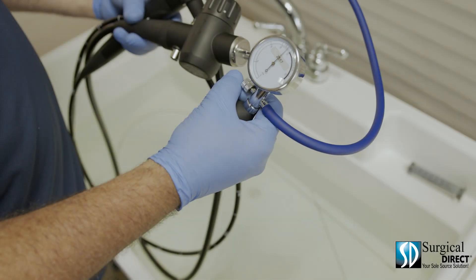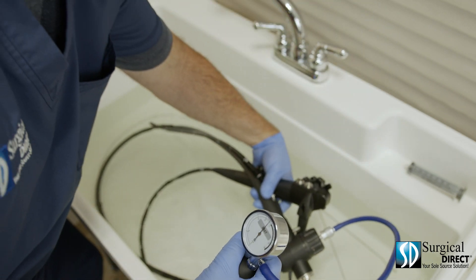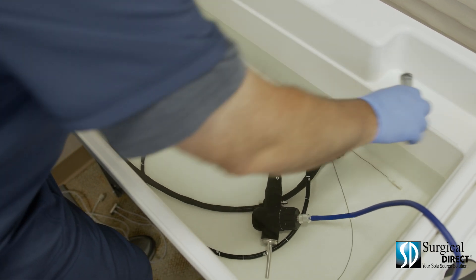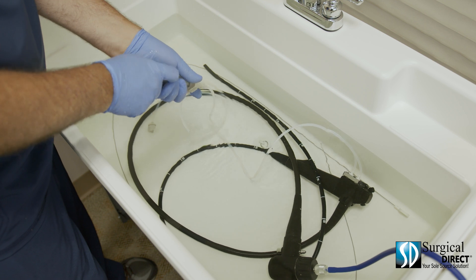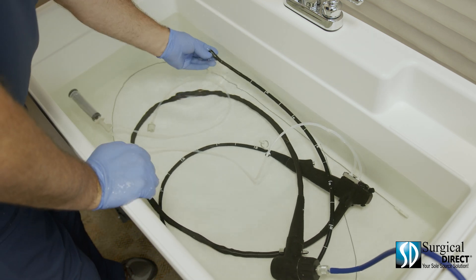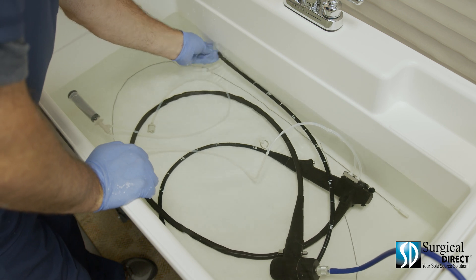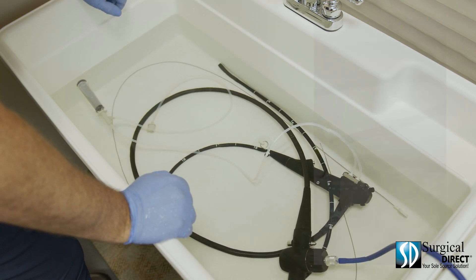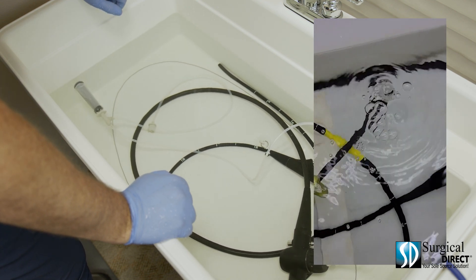With the leak tester still holding pressure, it is now safe to submerge the scope. It is important to always be looking for leaks in the endoscope. Using a syringe and your cleaning tubing, flush all air from all channels of the scope. It's easy to have a false positive when you don't remove all air from the scope. Check the scope carefully for any leaks. Most leaks will look like champagne bubbles; others may be even more prominent.